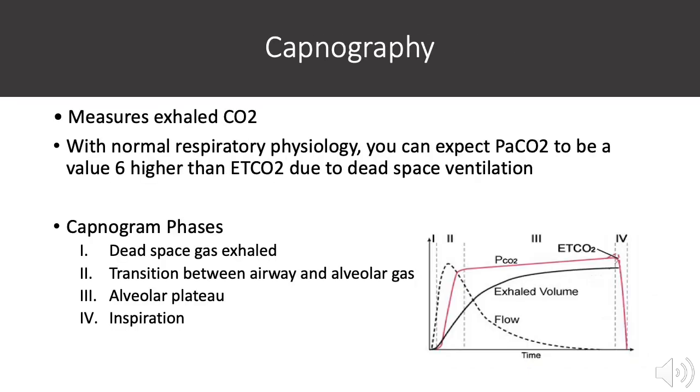Capnography is the measure of exhaled carbon dioxide. Capnography is displayed as a waveform on the monitor with each phase of the wave corresponding to each phase of the respiratory cycle or breath.